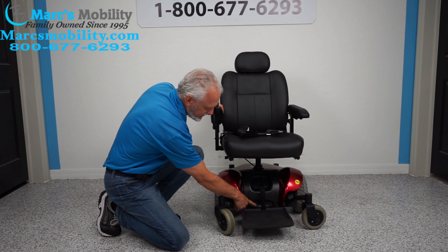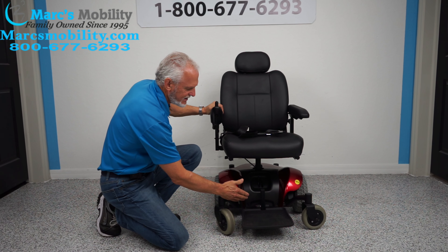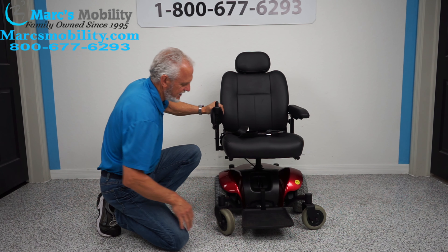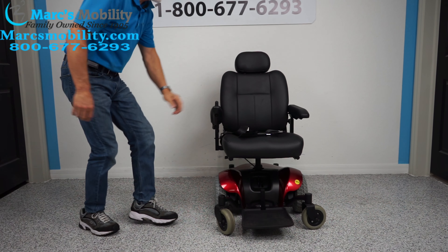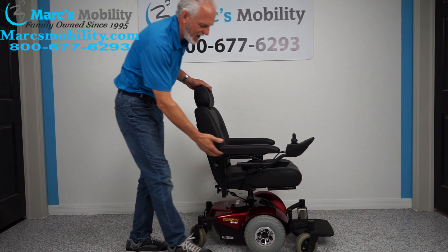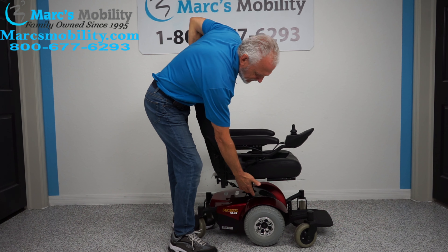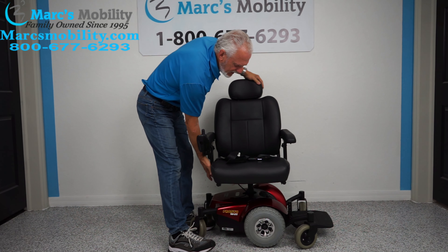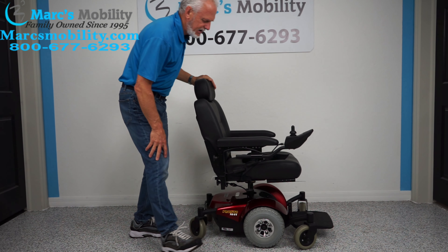The foot plate also can go out — there's a shaft that goes into the chair so you can go out a couple more inches, but right now would be your best turning radius because the foot blade is all the way in. Another thing about these Prontos that most people don't realize: they have a swivel seat that's easy to operate. Here's the handle — lift it up, and with one finger you can go from one side to the other, and it locks.